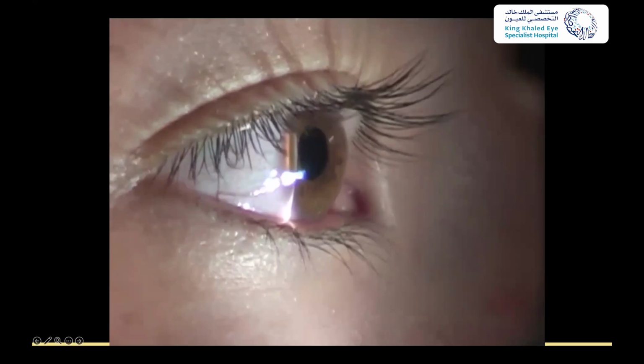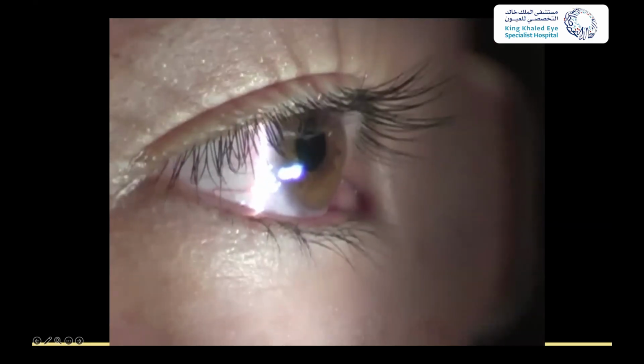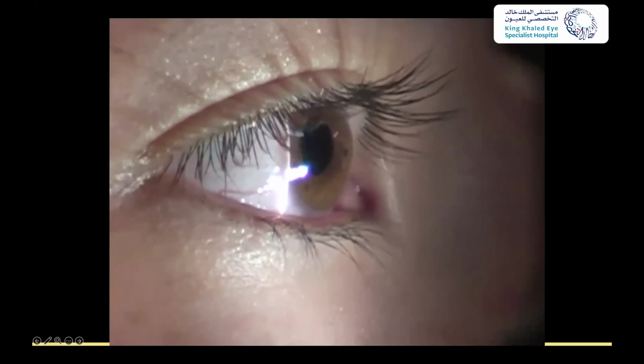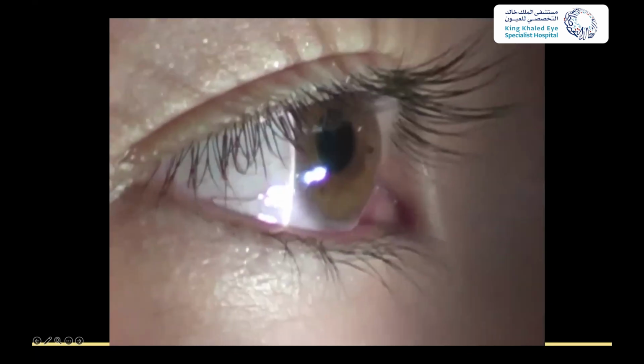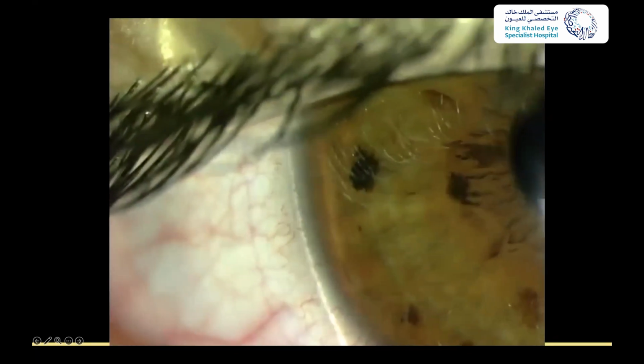So here I'm bringing this, I think this is Dr. Boese's eye, actually. I'm bringing this bright beam of light in from the far periphery, and I'm comparing the thickness of the cornea to the thickness of the anterior chamber. So the video will stop here a second, little rulers will appear.